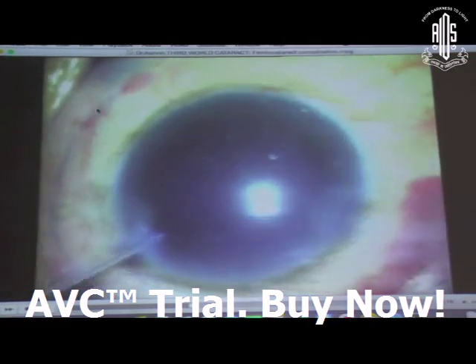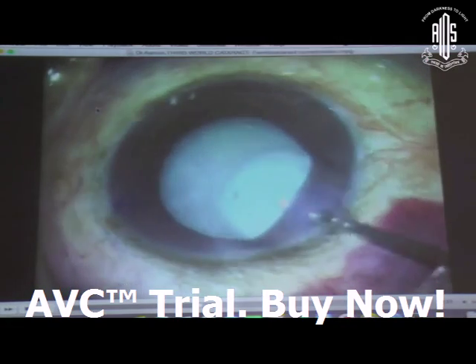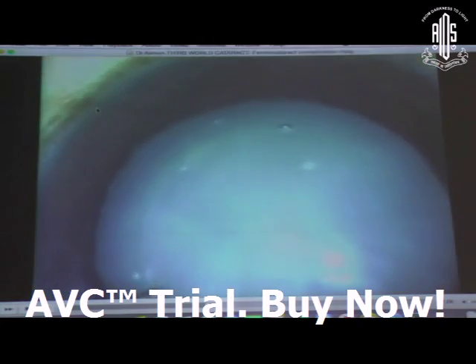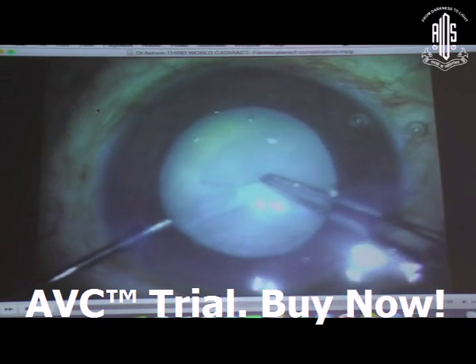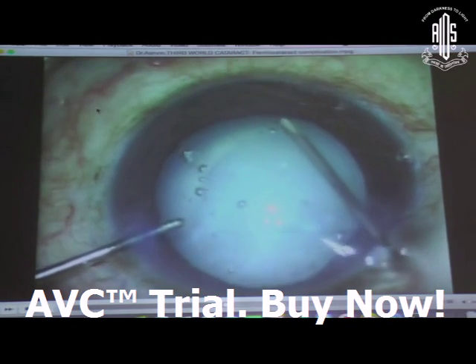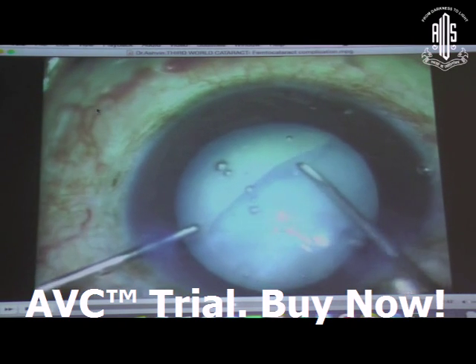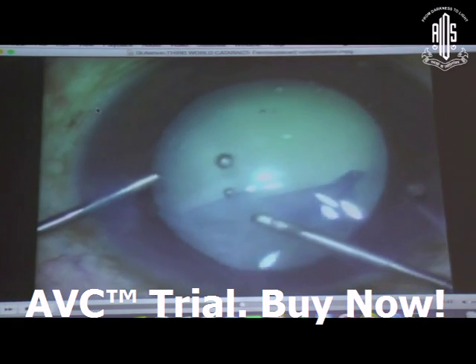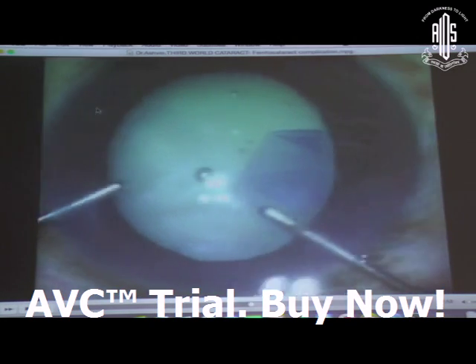You can see now we put up the rhexis, trying to see what's happening inside, whether there was a rhexis cut or not. Obviously, the clear corneal incision you can see was not cut. The rhexis is cut, as you can see, but watch it carefully, it's not cut fully. Now when you have done a femto and you have not been able to cut fully, you have to be very careful, and try to complete the rest of the portion with your needle or any manual technique of your choice. And that's what is being done here.